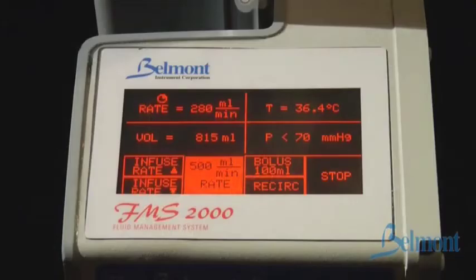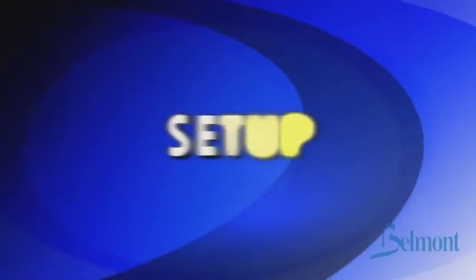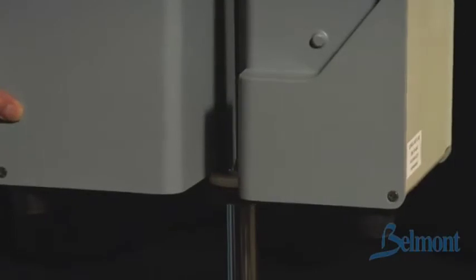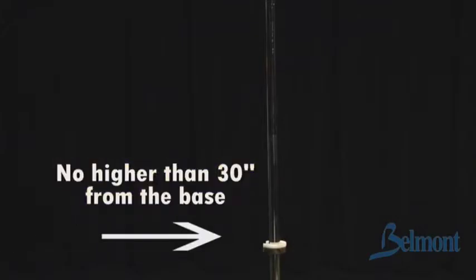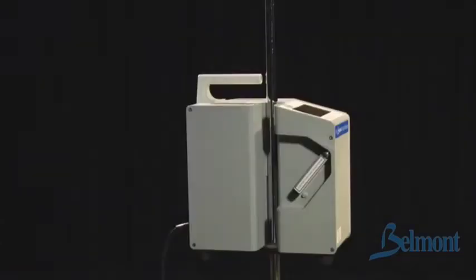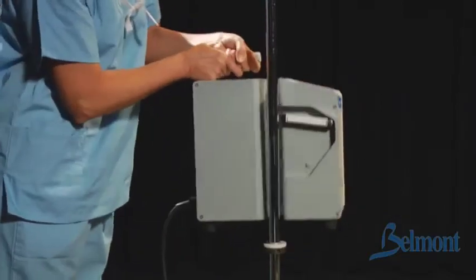There are two main components of the Belmont: the control system and the disposable set. First, mount the unit — the control system — on an IV pole. Remember to install the collar on the IV pole just beneath the system, no higher than 30 inches from the base of the IV pole. This will prevent the pole from tipping over. When removing the control system from the pole, be sure to hold the handle of the unit when you release the pole clamp to prevent damage from falling.